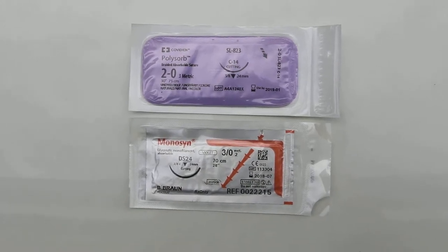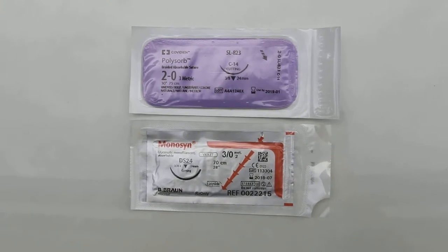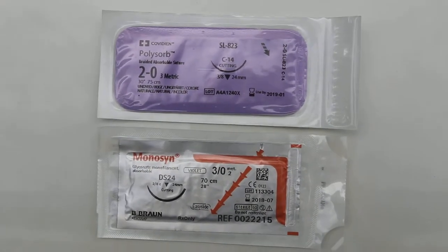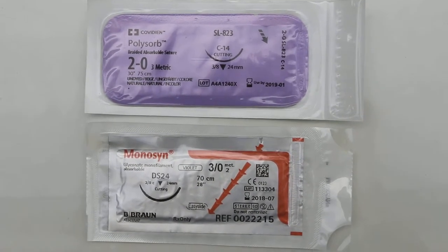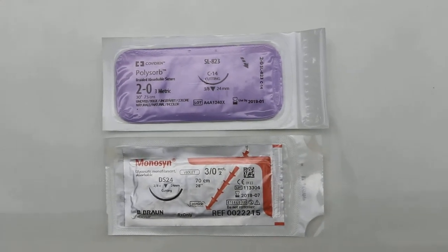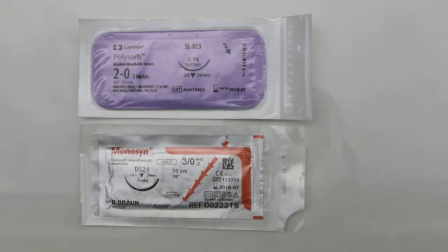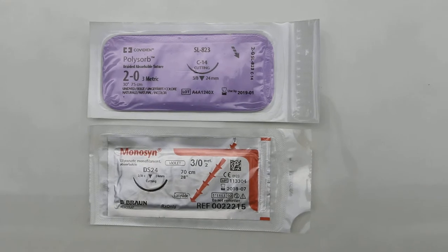These two packets of sutures were used for that case study of the poodle. Usually, one packet of suture will be more than enough to neuter a dog. I don't understand why the vet used two packets — the lower one for the inguinal undescended testicle and the upper one for the descended testicle.